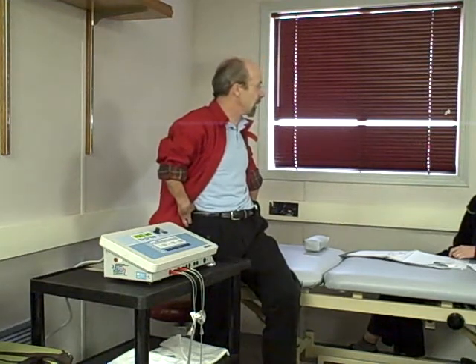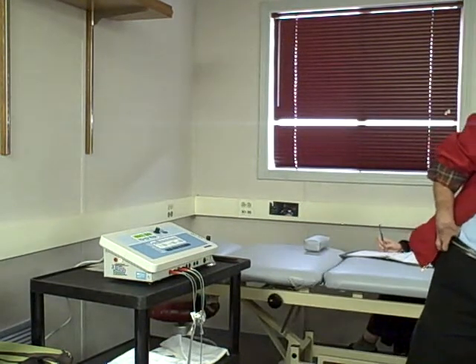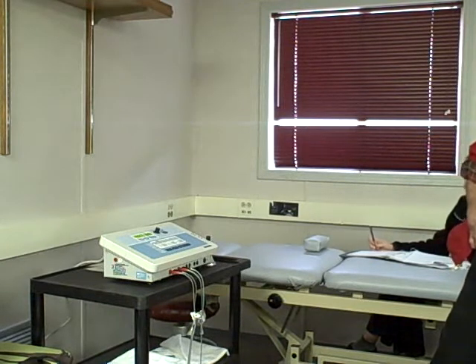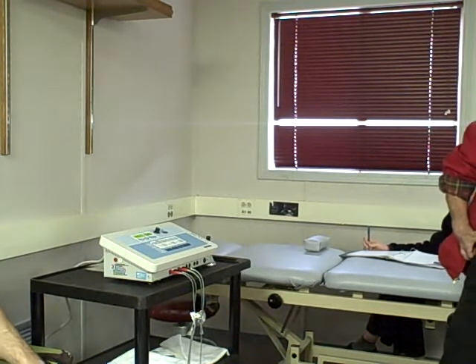Electrodes to surround the area. I want to surround that area, but I just can't do it, either because of the size of the electrodes, or maybe it's a shoulder. I want to treat right here, but where the one electrode would go, there's some broken skin or some kind of raspberry thing, and I don't want to put E-stim over that. That will just aggravate it. So you kind of go, okay, what's the next best thing?